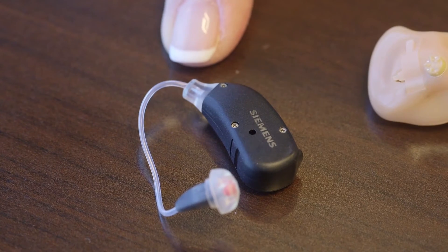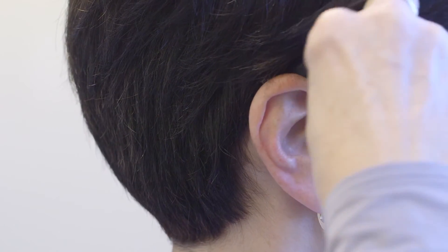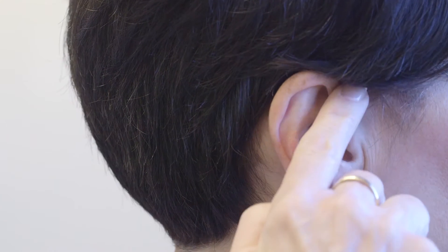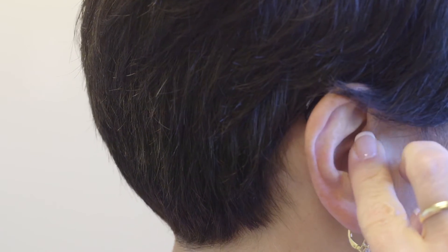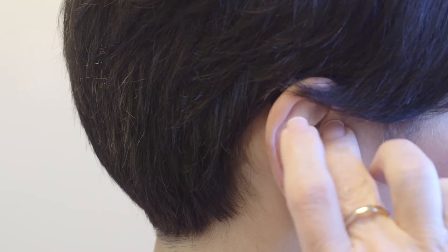Behind-the-ear hearing aids are worn over the ear, where the device sits behind your ear. There's a small thin tube that directs a speaker into the ear canal. Once in place, they are hard to see.